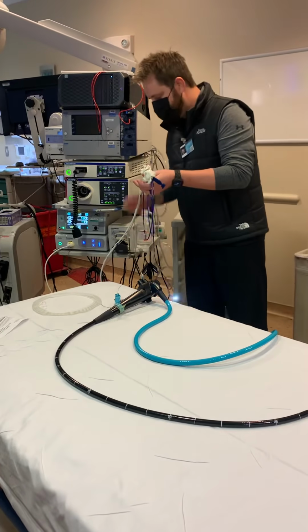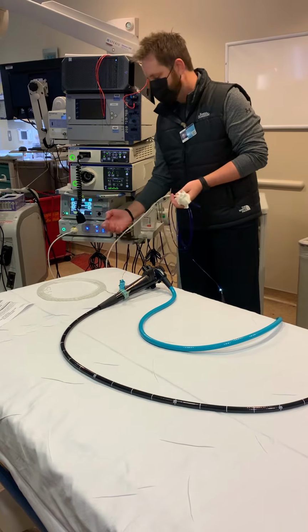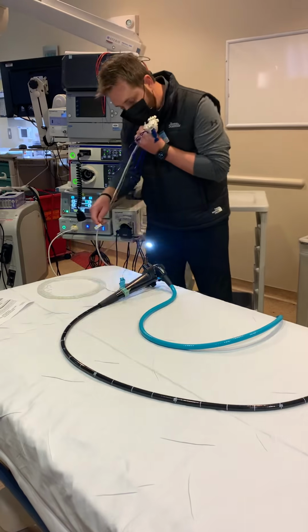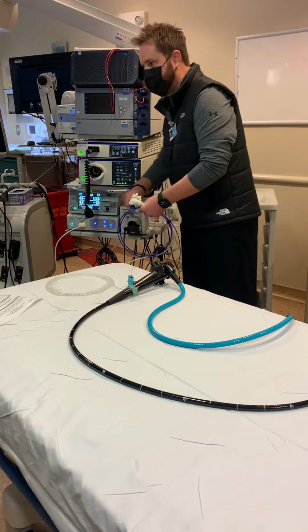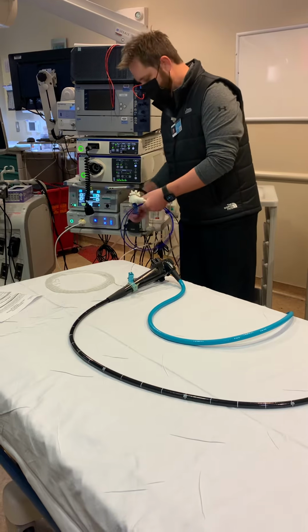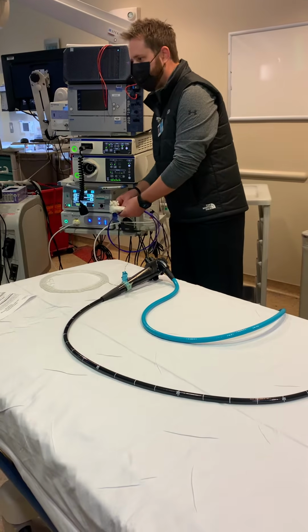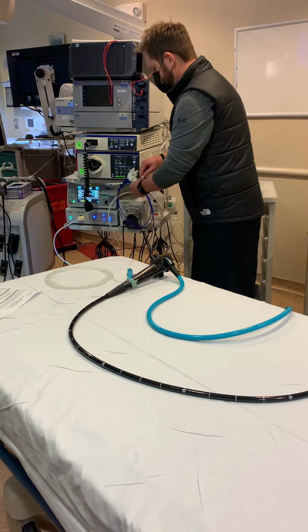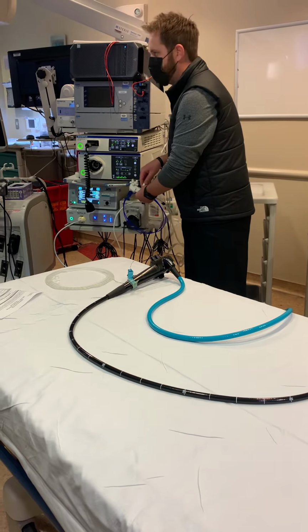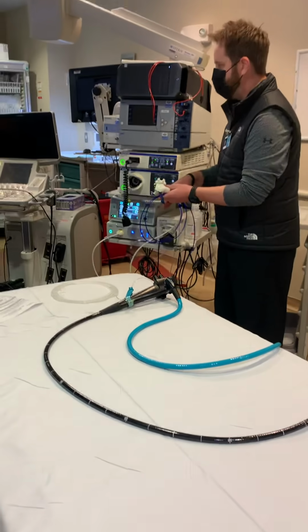And then off of this catheter, you have 2 connection points. The first one, which I love, has blue water droplets on it. This is where we connect that irrigation pump tubing directly to here. The second one is the suction port. It normally has a stopcock, but I broke it off of my demo catheter. But either way, you'll take your suction and you'll just press fit it directly onto this point. Now we have suction, irrigation, and our Spyglass catheter. Okay?